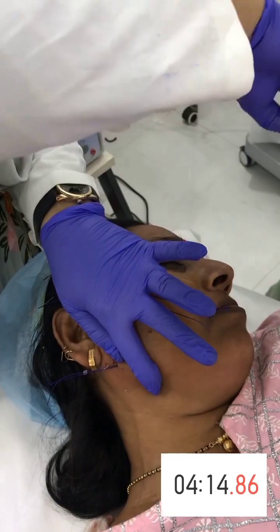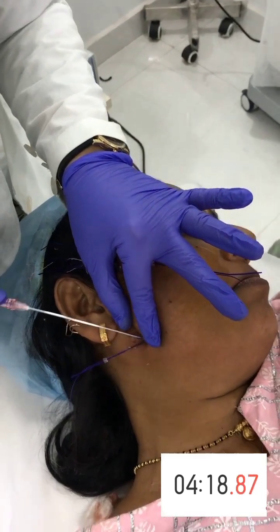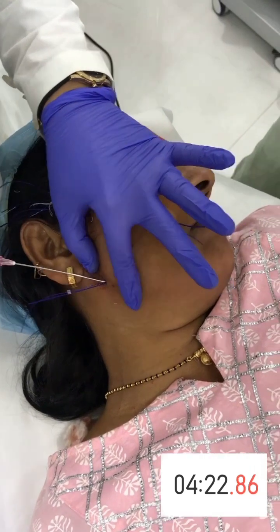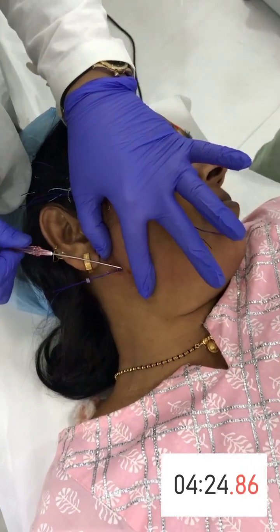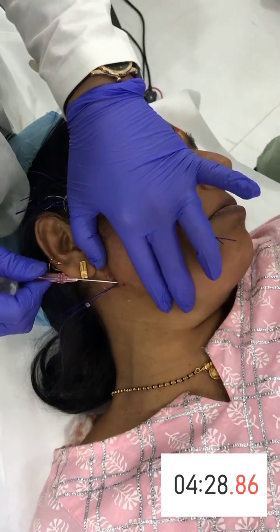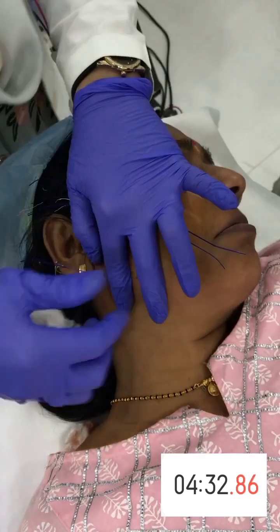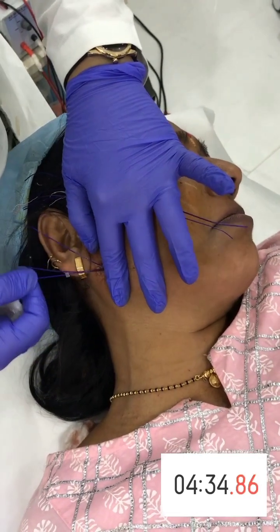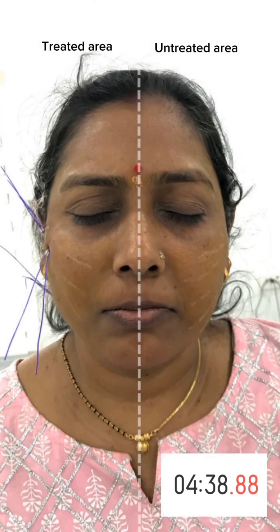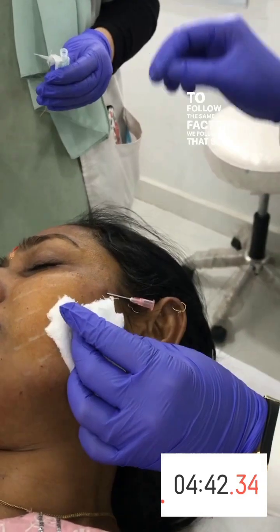Going to follow the same vectors we followed on that side.